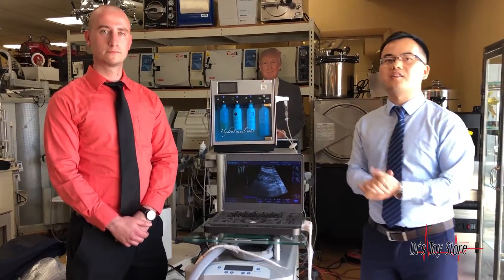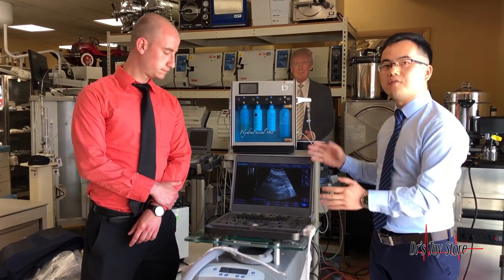Let's welcome Mike, the marketing and sales manager from Dr. Toy. He will give an introduction of our amazing laptop ultrasound, the X5.